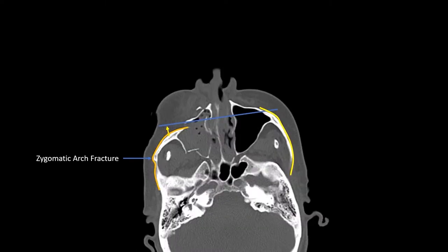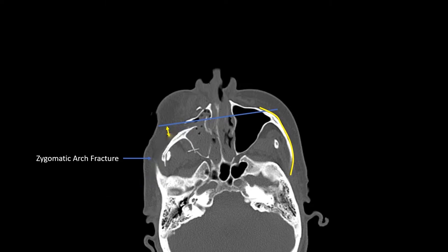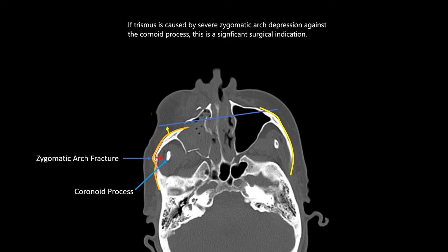You can see a zygomatic arch fracture noted. One thing to note is the normal curvature of the zygomatic arch highlighted in yellow, while the fracture side shows the zygomatic arch shape has been grossly distorted. This section of the zygomatic arch can sometimes be depressed, and if depressed further, it can potentially push up against the coronoid process of the mandible and result in trismus. If you see trismus from severe zygomatic arch depression, this is a surgical indication because the patient will not be able to open their mouth. In this case, due to the lack of significant zygomatic arch depression, I would anticipate the patient to have near-normal mouth opening once pain is controlled.